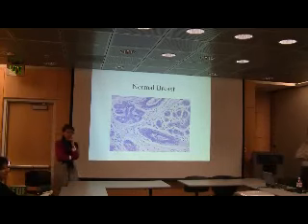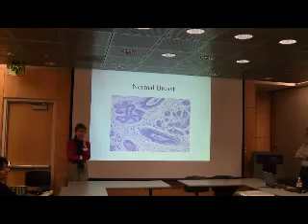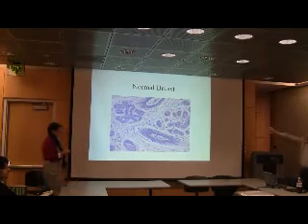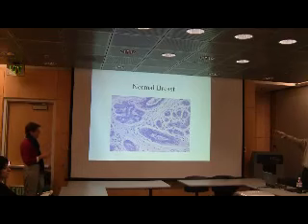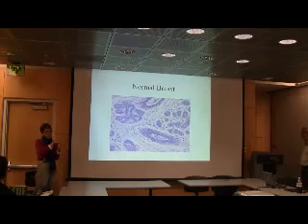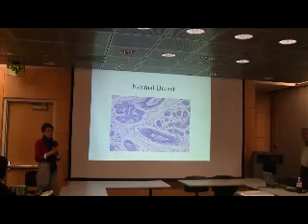I mean, we understand all the cartoons, like this is what a normal duct looks like, and then DCIS and all this, but how do you tell, because it's cut like this? How do you tell if it's just cut a certain way, or if it looks like a pathology? It looks like a mess to you and me, but in fact, Britt has trained her eyes over 20 years of looking at this. She can see that this is only one layer. She can see it's tangentially cut, so it piles up a little bit, but it's within normal limits. So I know this is normal.